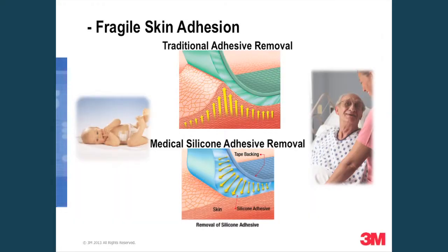The silicone matrix and gel adhesives have a unique structure internally. You'll find that they're mostly 4 to 6 mils thick. There's a lot of 6 mil ones. The 3M ones are 4 mils thick, but they have almost like an internal spring effect. They stretch to remove. It doesn't cause the skin to stretch to remove. So it helps reduce trauma by absorbing that energy internally to the silicone adhesive. And that's why you can get such a nice, gentle and painless removal or reattachment for the silicones.